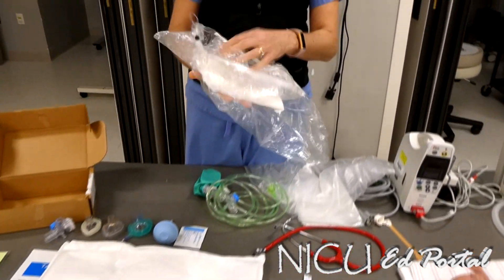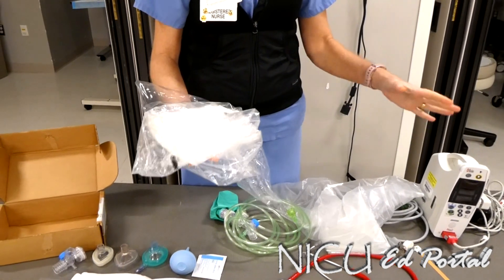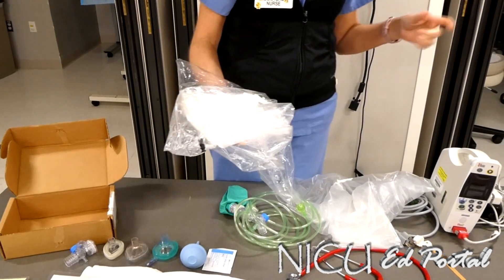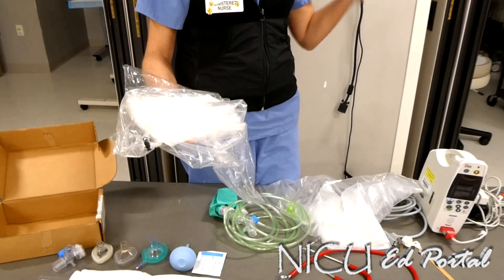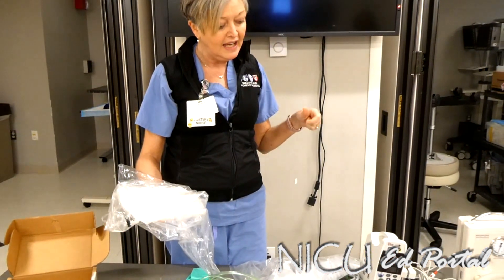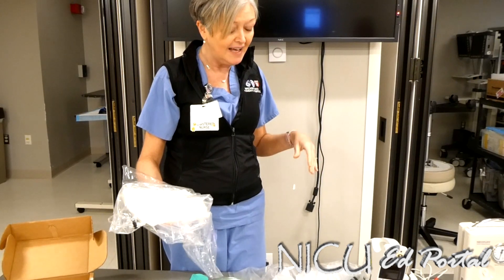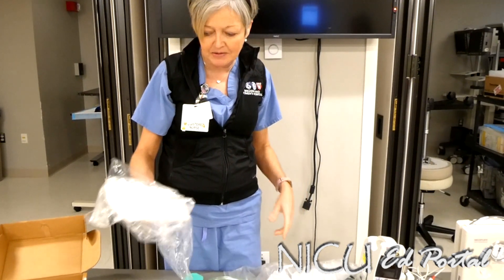For babies that are born very small, we do not dry the fluid off them. So we want the ambient heat in the room to be quite warm. I know our operating rooms are usually freezing, so we usually want to jack up the heat a little bit. And of course, make sure that the warmer on the bed is cranked to at least 100% — we want it as warm as possible for this new little person that's about to come.